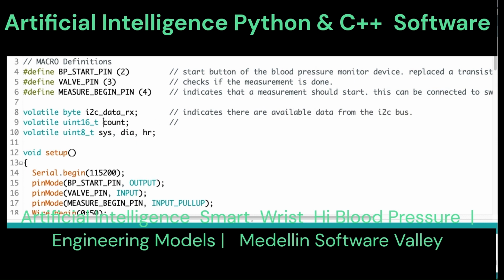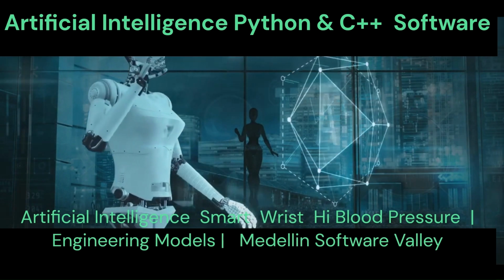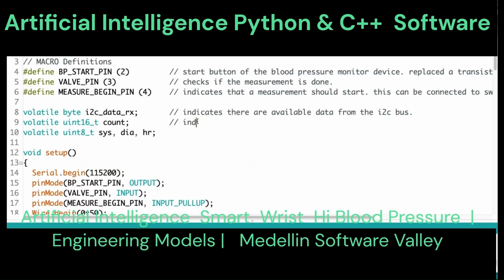The sensor displays systolic and diastolic values. There is also an air pump and solenoid as the pump and air regulator that will enter the cuff, and an SD card module as the main CPU storage system that will store measurement data.